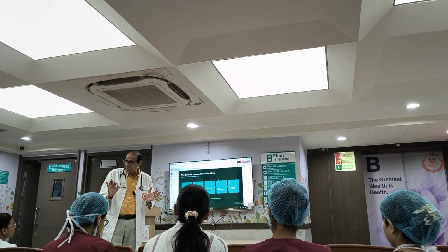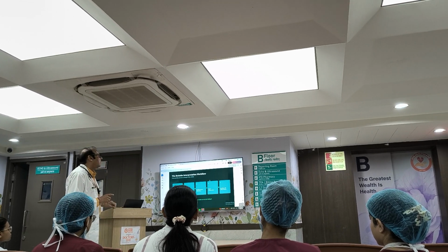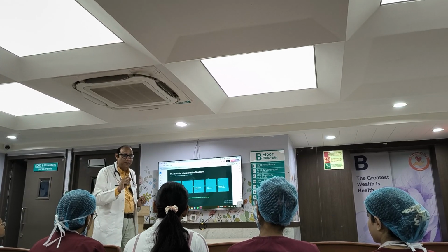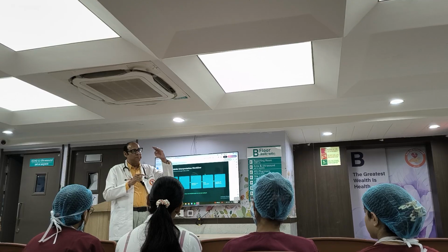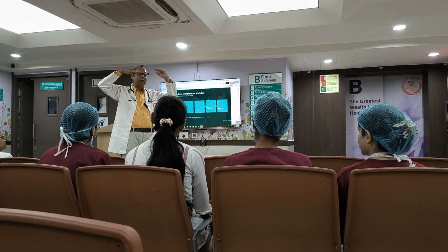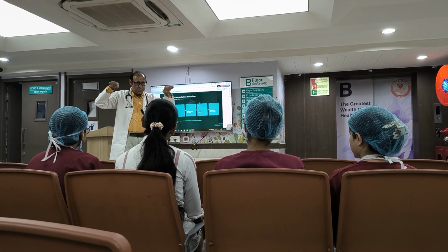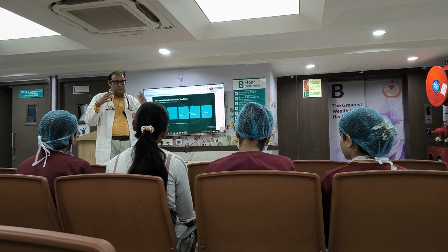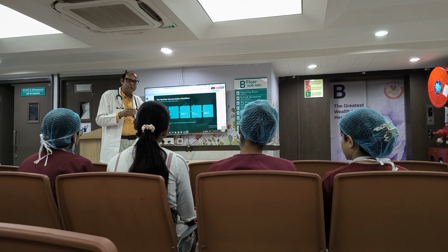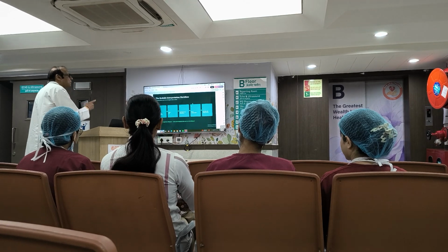Any doubt? When you say so, then we go for the next. After that you see what happens: compensation happens. If a patient with COPD, the body compensates. If for example PCO2 is going high, the body is going to compensate it, so bicarb is also going to be high. So they try to be like a seesaw, on the same level. If the patient is not going to compensate, then decompensation starts, where acidosis and alkalosis happen. Okay, and correlate with patient and treatment.